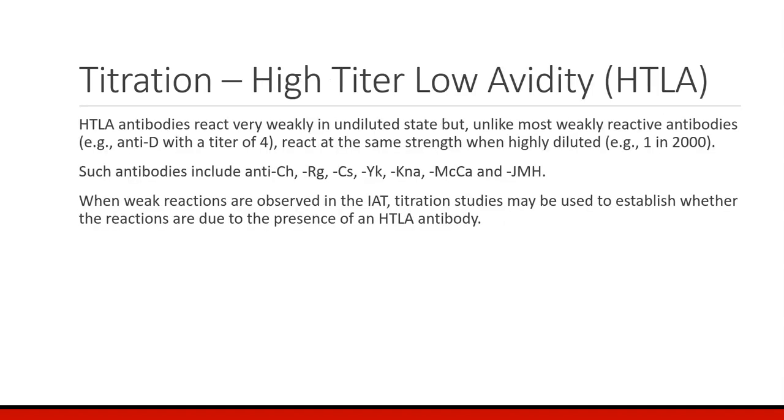Another application of titration is for high titer, low avidity antibodies, also known as HTLA. HTLA antibodies react very weakly in undiluted states, but unlike most weakly reactive antibodies, for example, an anti-D with a titer of 4, these HTLA antibodies react at the same strength when highly diluted, for example, 1 in 2,000.